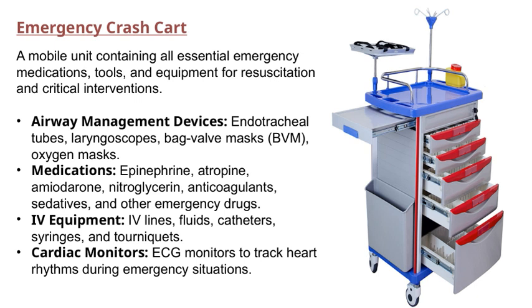Having these readily available means we can secure the airway promptly and ensure the patient gets enough oxygen, which is vital during emergencies. Next, we have the medications. The cart stocks critical drugs like epinephrine, atropine, amiodarone, and nitroglycerin, along with anticoagulants, sedatives, and other emergency medicines. These medications are essential for treating arrhythmias, cardiac arrest, and other life-threatening conditions.